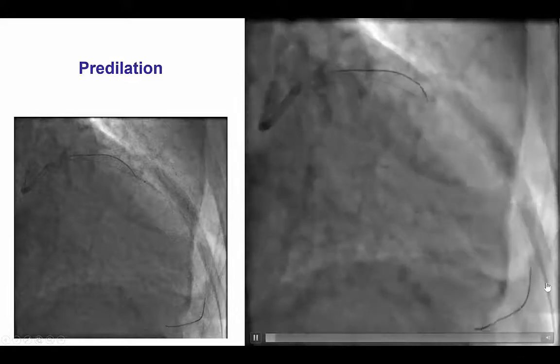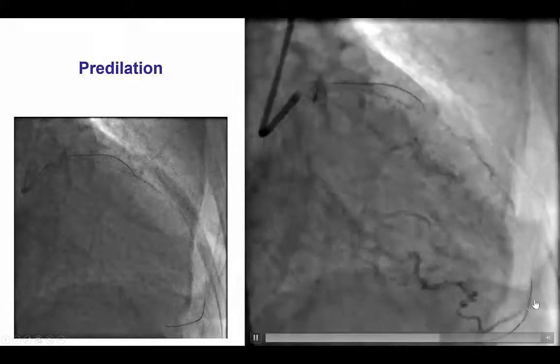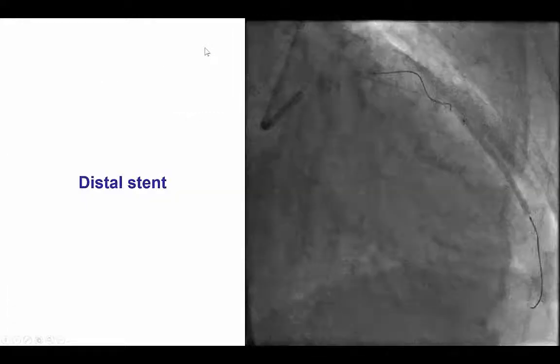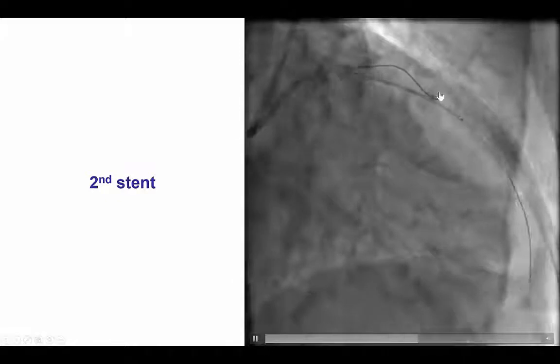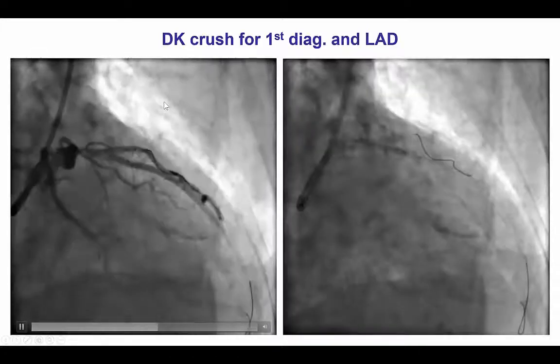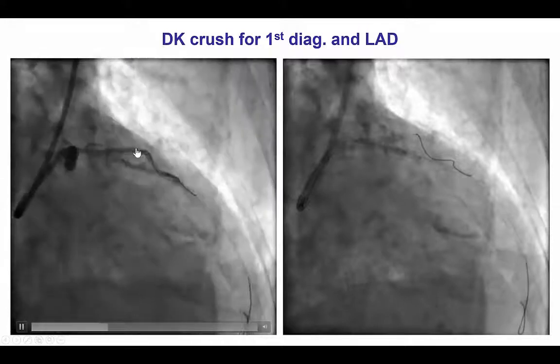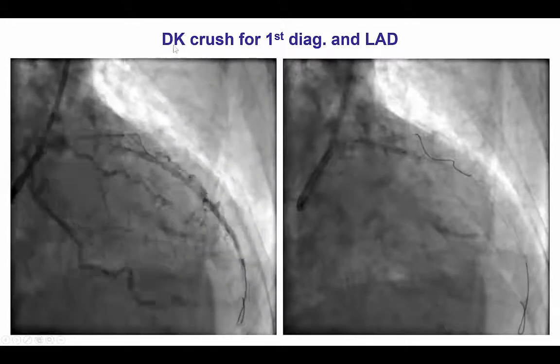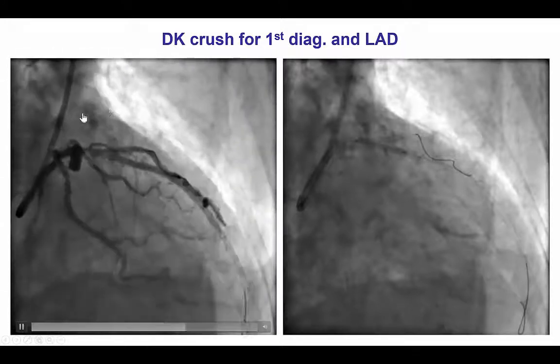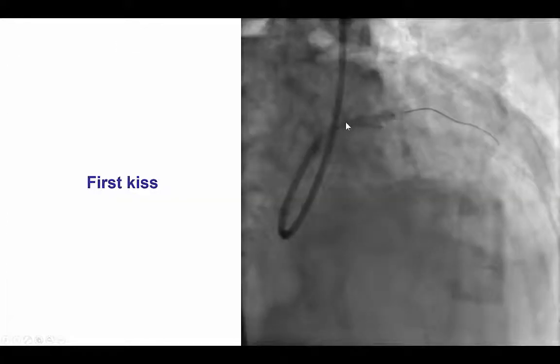The microcatheter was advanced into the distal vessel. The Pilot 200 was exchanged for a workhorse guidewire, as we do for all CTOs, and stents were placed in the distal to mid LAD as well as more proximally. We maintained the wire into the large diagonal branch to ensure access, and given the use of a dissection re-entry technique with such a large branch, we decided to use DK crush — double kiss crush — for the first diagonal and LAD. A stent was first inserted into the diagonal branch and crushed with a balloon in the LAD. The diagonal branch was re-wired and the first kiss was performed.